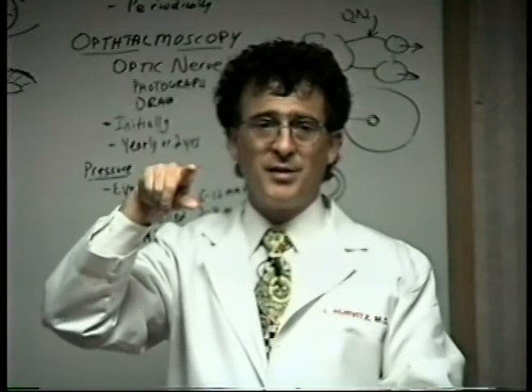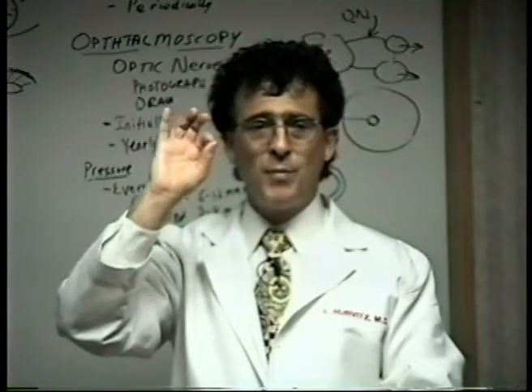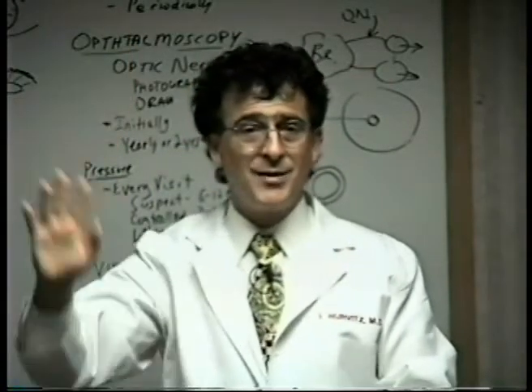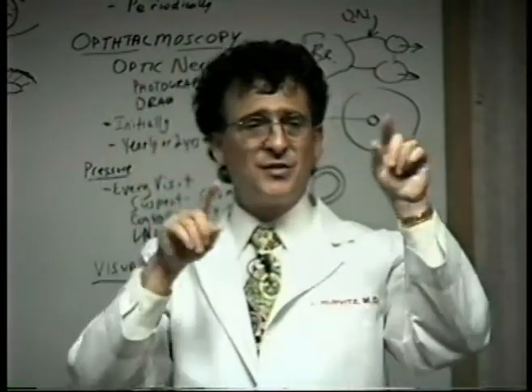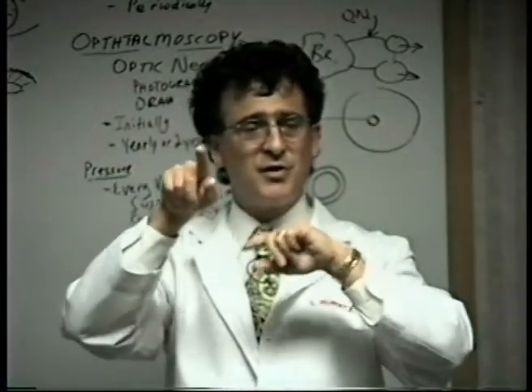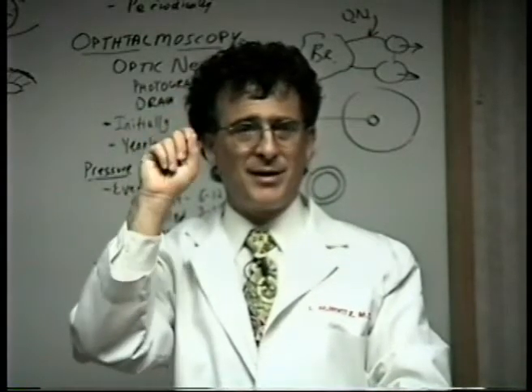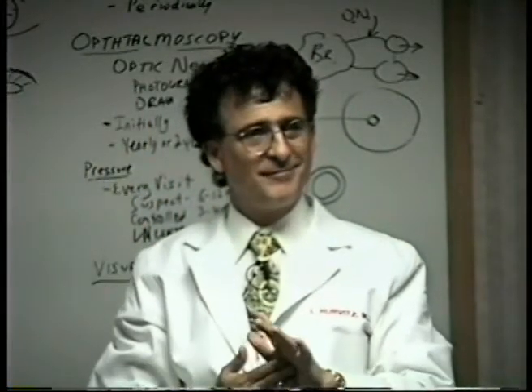And then once you do see it, it makes it dimmer and dimmer and dimmer again until you don't see it again. And it comes up with a numerical number for how sensitive your eye is at that spot in your visual field. That's a lot different than do I see my hand waving, right? But you can imagine how complex it is, and the machine is in the midst of doing this at random in 72 different spots. And it remembers where it is in every spot during this algorithm of varying the light to try to find it. So it doesn't stay in the one spot. You know it's coming back there, it's coming back there. It varies it, so it's testing here. And it remembers where it is at each spot. And then it prints it out.